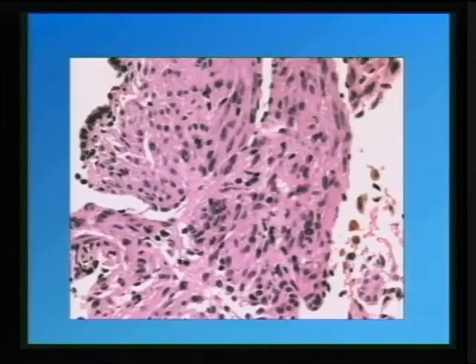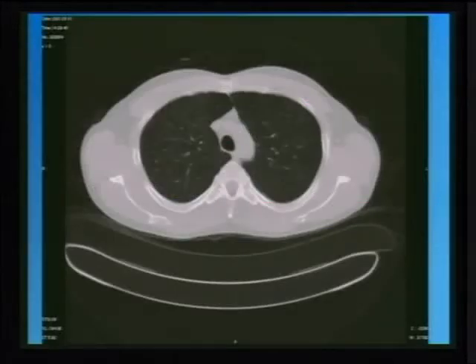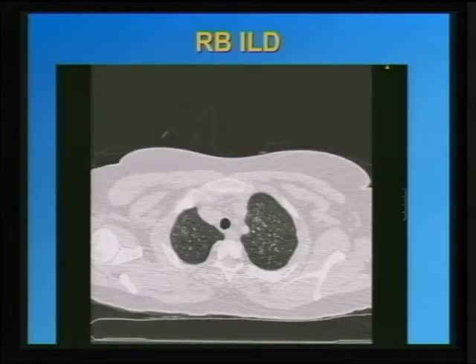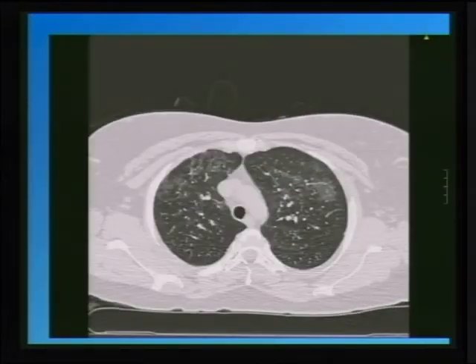The one that I want to talk about is RBILD, is the fact that it does have this acinar kind of disease where you see these fine ground glass opacities. I don't know how well it's projecting there, but in a heavy smoker, this is easily recognized. Those are fixed findings of ground glass opacities that are small, 5 to 8 millimeters in size, and sometimes they can be more geographic, like in this patient. But those can be reversible, and those represent manifestation of inflammation in patients that are heavy smokers.